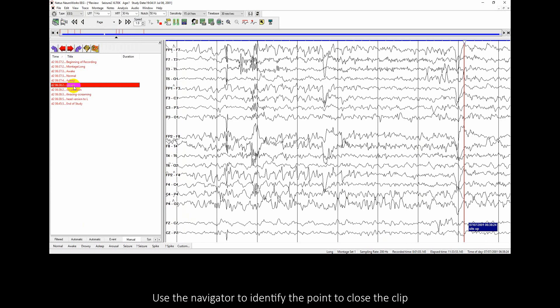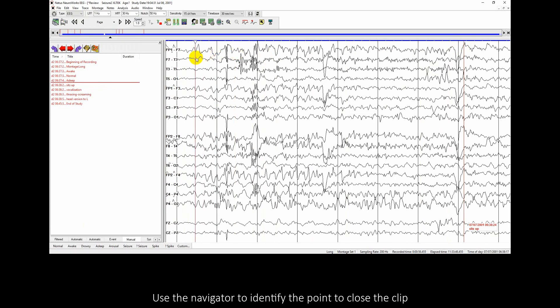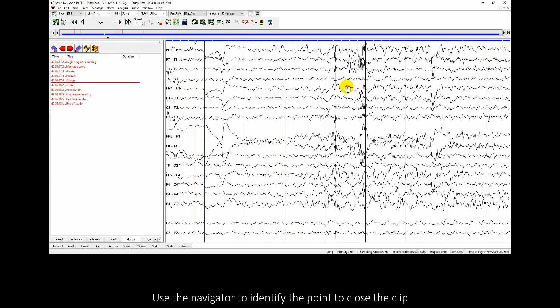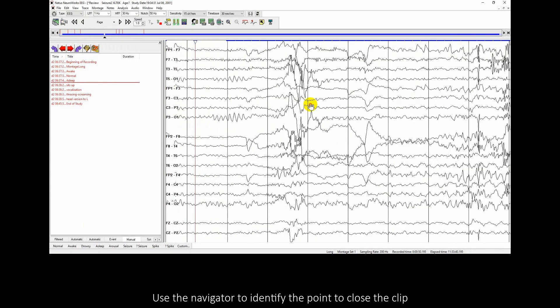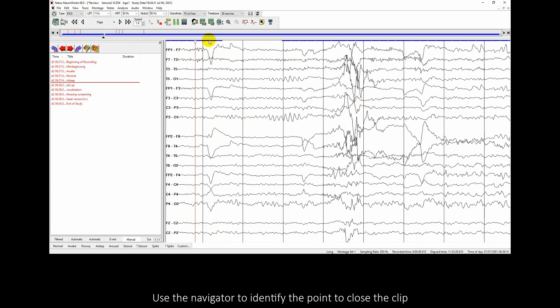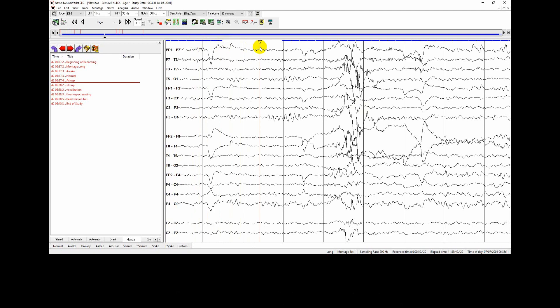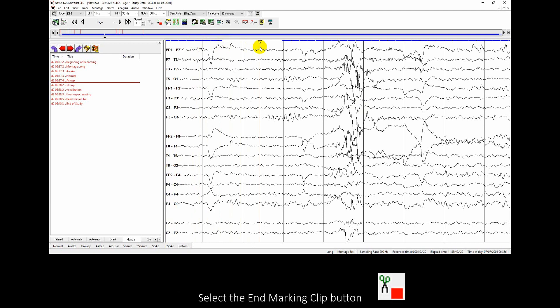Use the navigator to identify the point to close the clip. Select the end marking clip button.